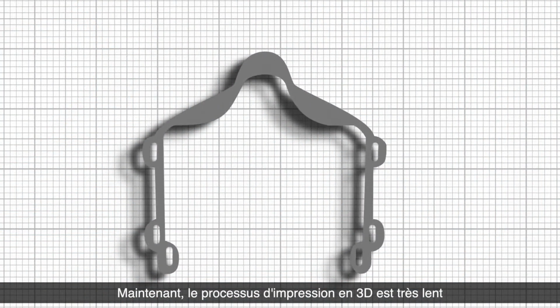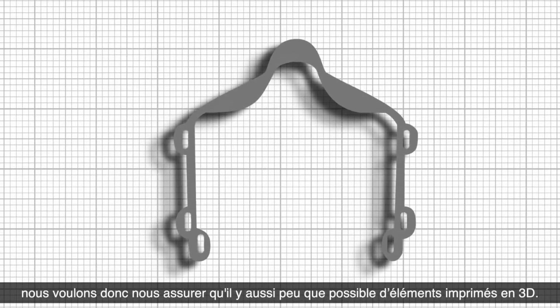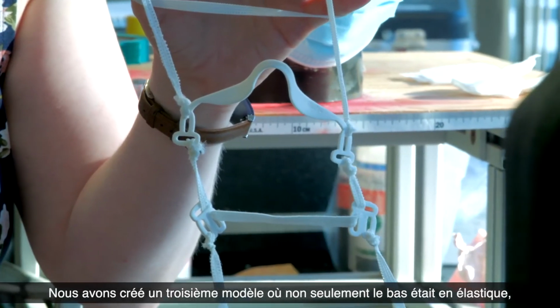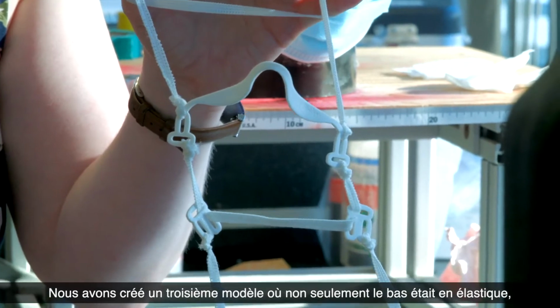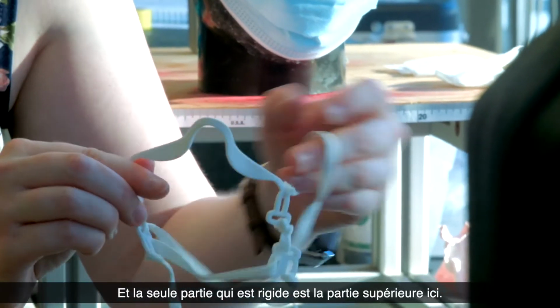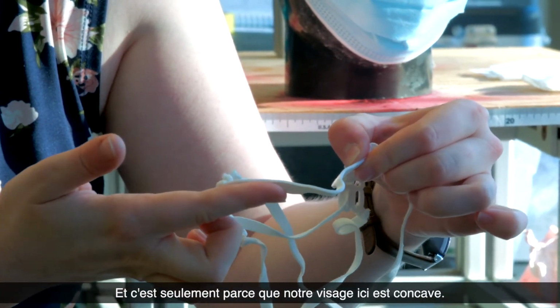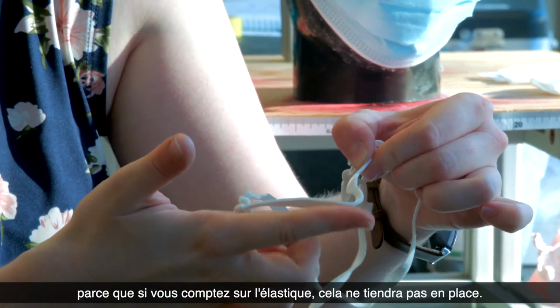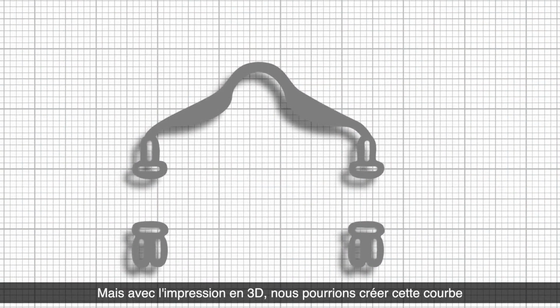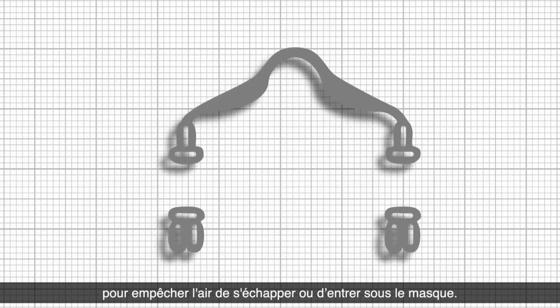Now, with 3D printing, it is a very slow process. So we want to make sure that there's as little 3D printing as necessary. We designed a third model where not only the bottom was made of elastic, but also the sides. And the only part that is rigid is this top part here. And that's just because our face here is concave. So you can't rely on elastic here, because if you relied on elastic, it would just go straight across. But with 3D printing, we could create this curve to prevent air from escaping or entering the mask.